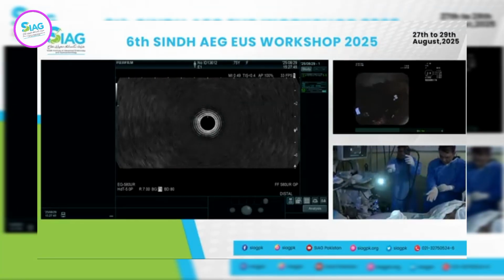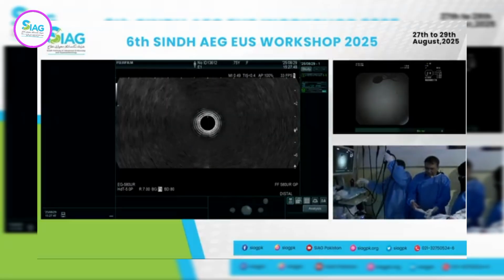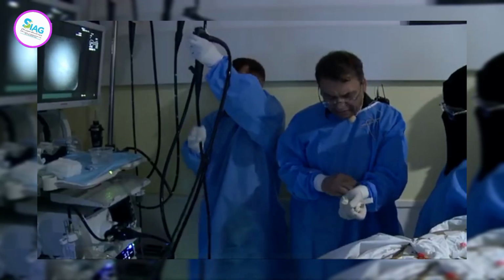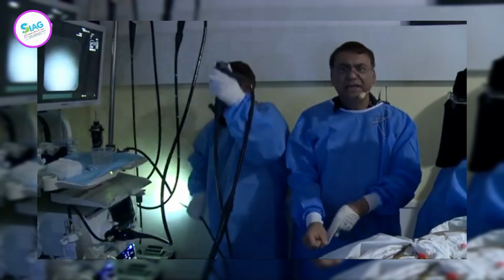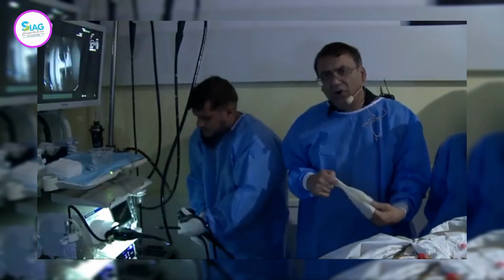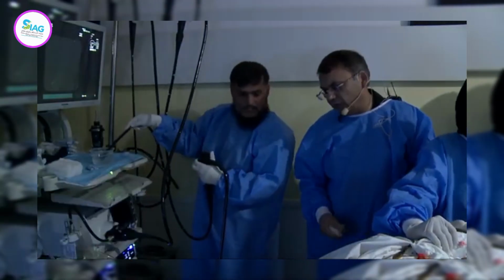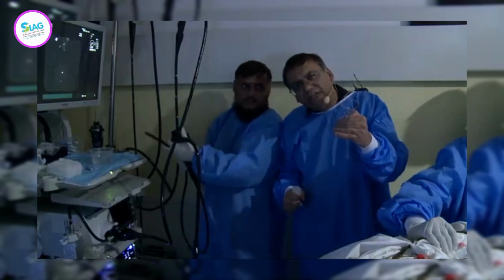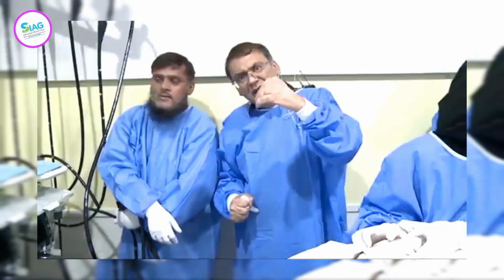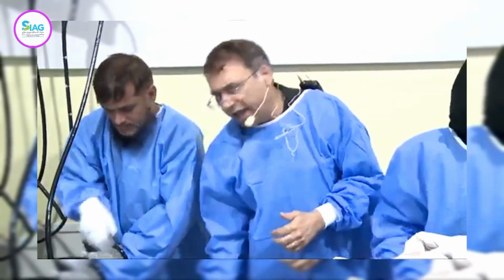That was it. It's a very quick exam usually, unless you have to biopsy something or drain, like a rectal abscess. Sometimes we drain that, or if there is any other lymph node or metastatic area. Sometimes we look at the fistulas as well, and that usually looks like a breakage into the muscularis propria. That's how the fistula looks.